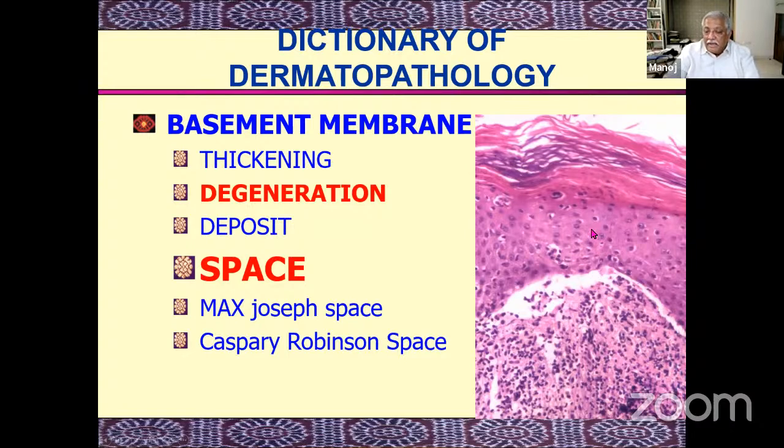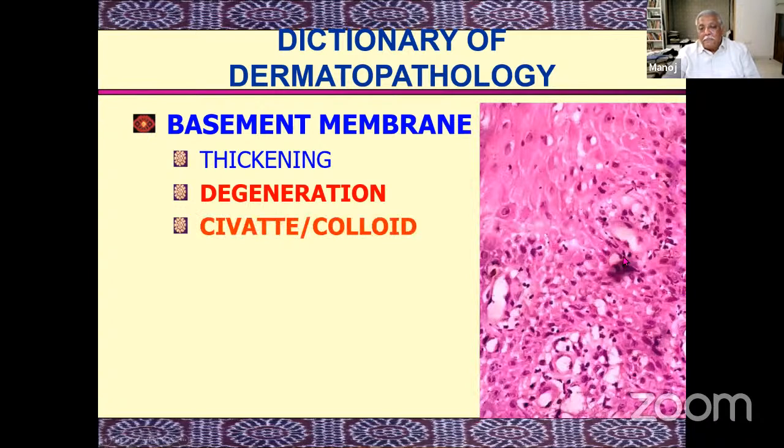Now that dying out, you might go back a few slides and remember I had showed you one little orphan red cell lying in between the pink cells. Yeah. So that is again part of the process of degeneration caused by inflammation. What happens is that all this inflammation which is going into the epidermis is causing degeneration of cells at all levels. And you can in fact make out here you have a relatively normal epidermis. Now, this cell is degenerating much before it should be. It should be degenerating like this here.